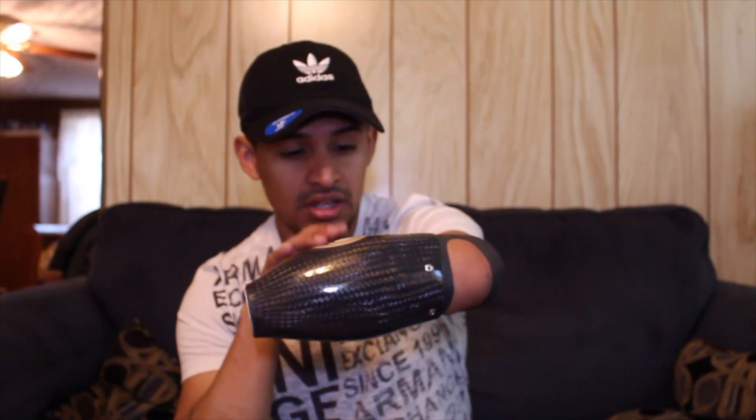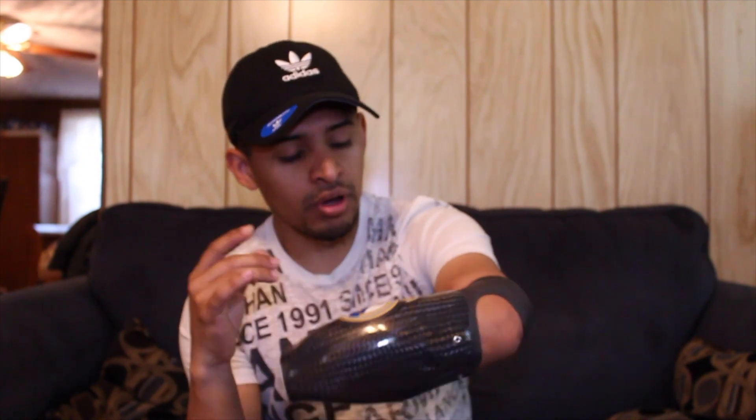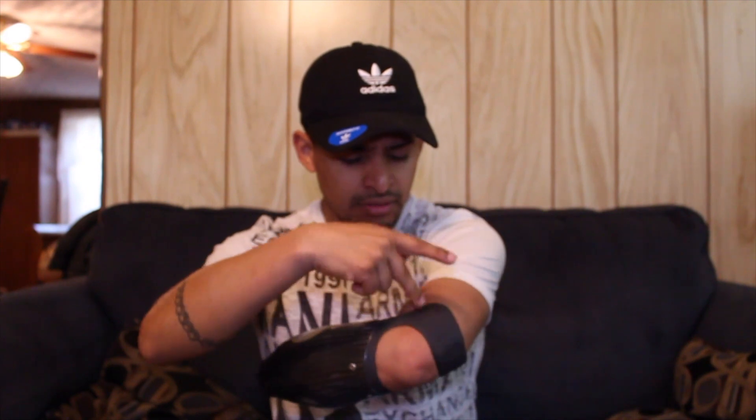Just this forearm part, it costs like $25,000 to make. You can have different colors, you can have logos, you can put stickers or different things on the forearm that you want. And this thing only costs like $25,000 — that's how expensive it is.